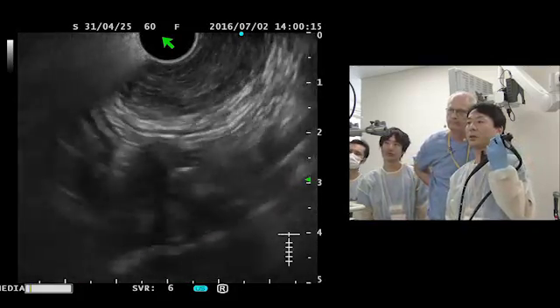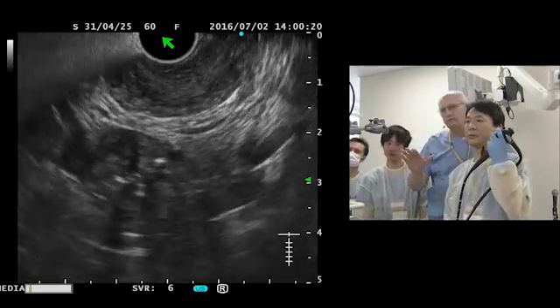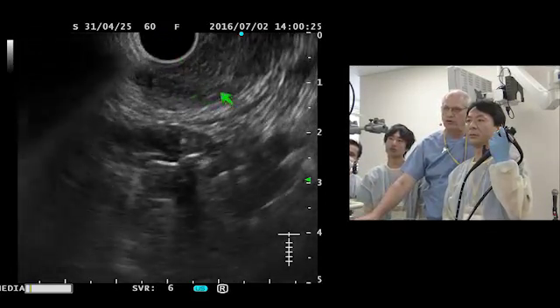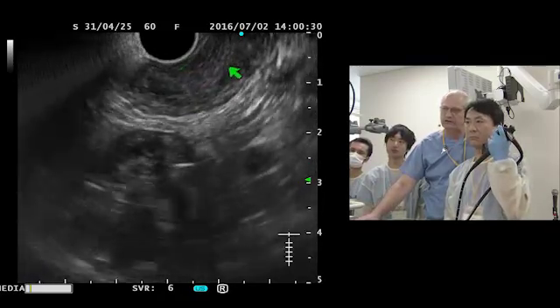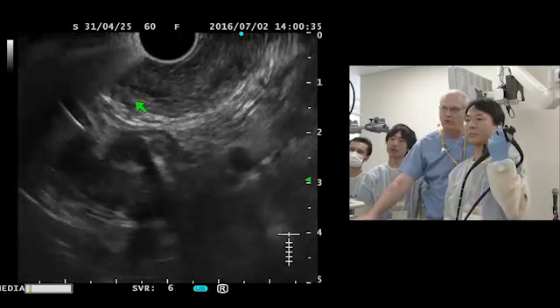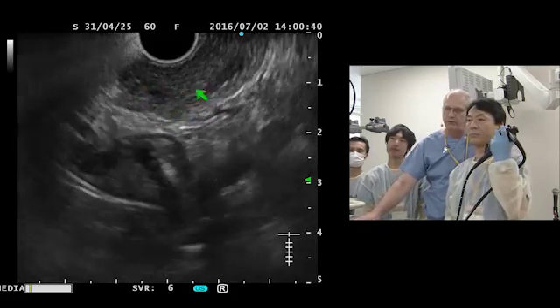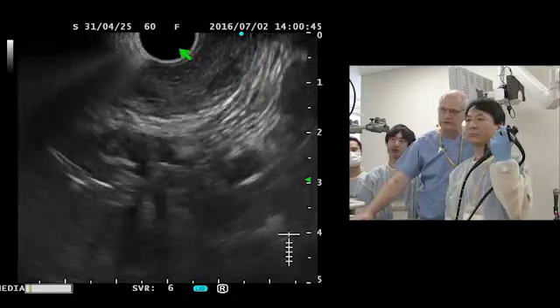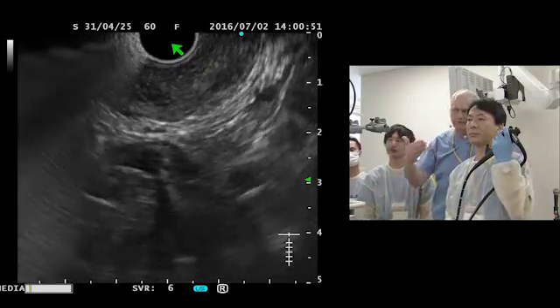And this is a US image. So again, I think that what impresses us, as Dr. Ryouzawa showed, is it seems to be inhomogeneous. There are some darker areas and lighter areas, and then the outer border normally is very, very smooth, but the outer border is not so clear. So these are two worrisome features that make us think of a more advanced lesion.